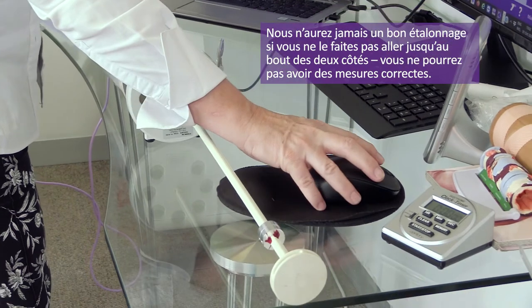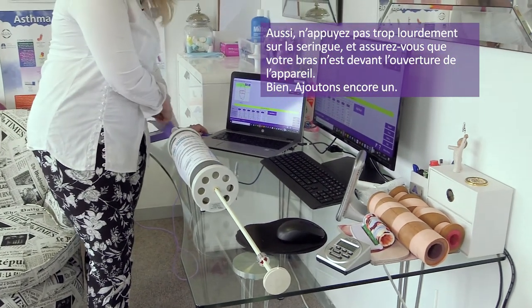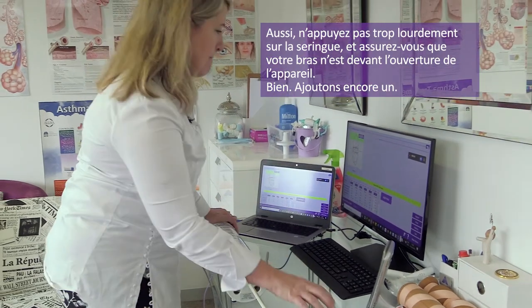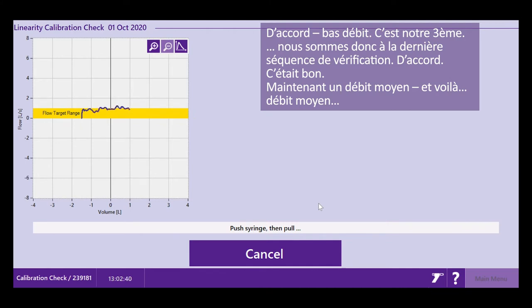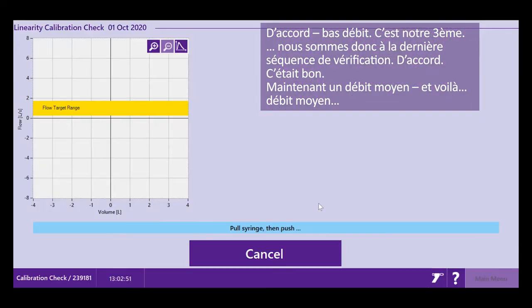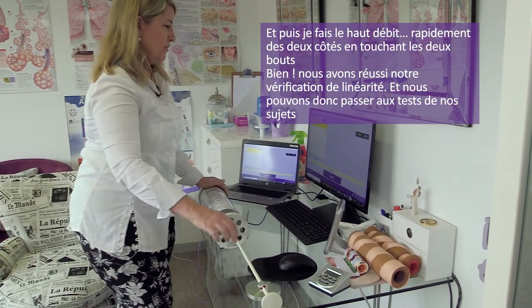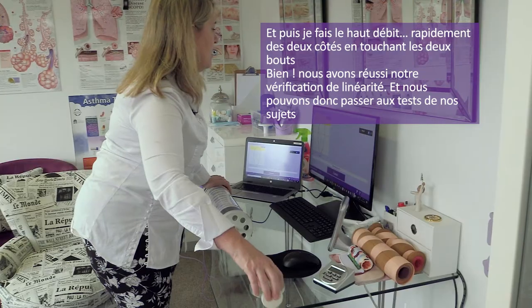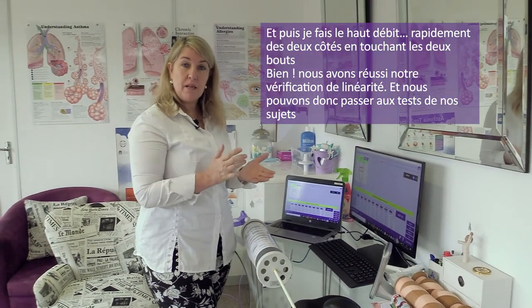Be careful not to push down too hard, and make sure your arm is never in front of the device itself. Now our third low, third medium, and third high flow — fast in and out, remembering to touch every side. Our linearity check has been completed successfully. We can now go on to testing the patient.